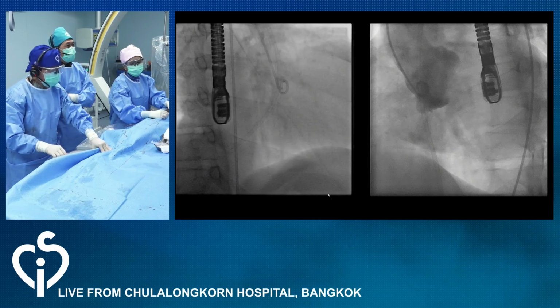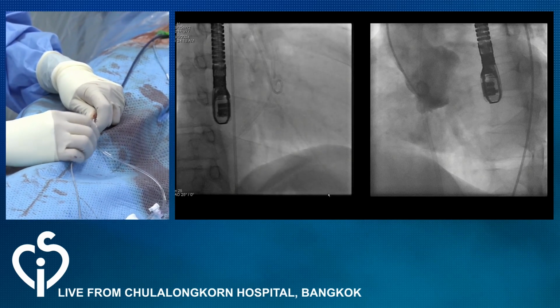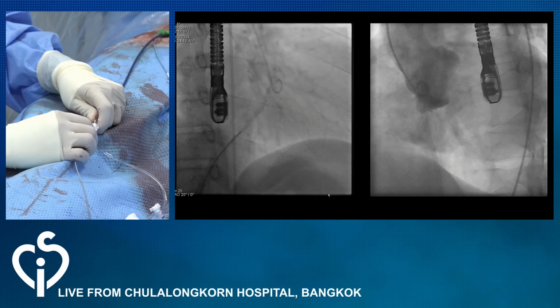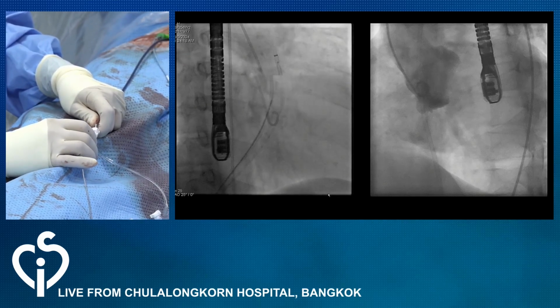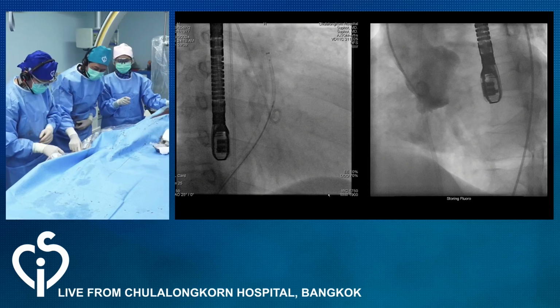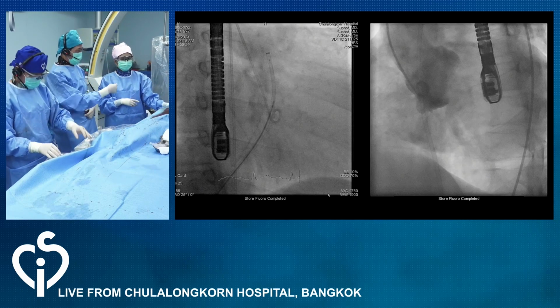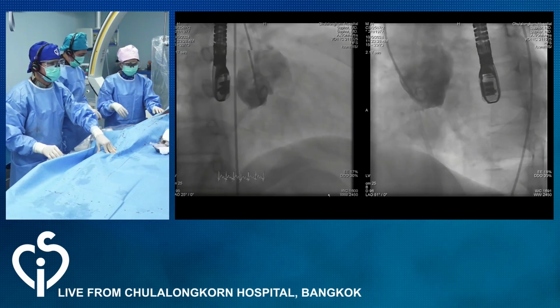Hang on, Bharat. They're not across the tricuspid, are they? No, but they are close to it. It's probably in the anterior 1/3 of the non-coronary cusp. Okay. So probably close to the annulus, just to see. And the second thing, I was wondering whether this shunt is truly 1.3:1. Angiographically looks a rather significant shunt.